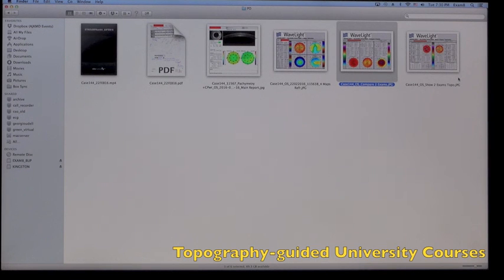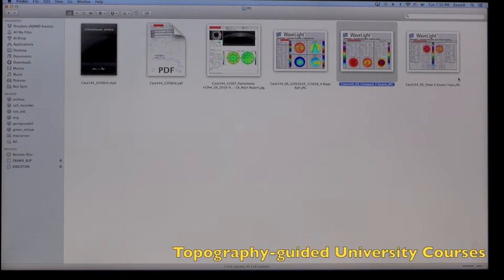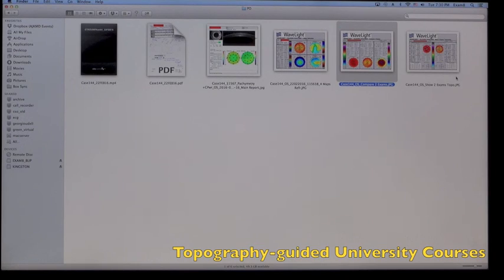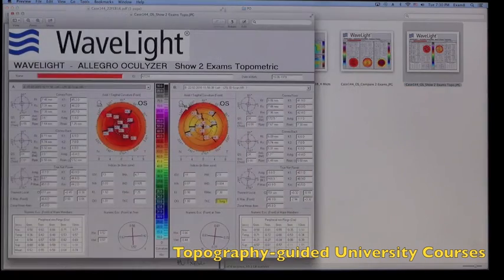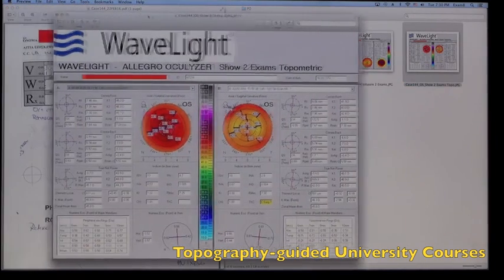And again, in sagittal anterior segment curvature, and let's click on the topometric indices, which is the last picture on the right here.